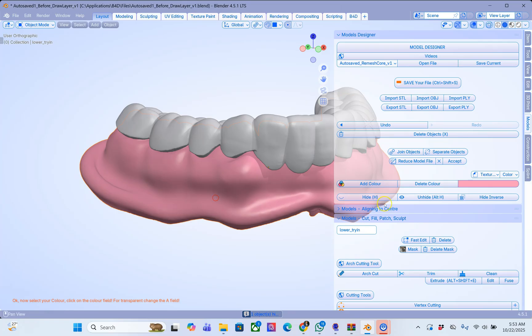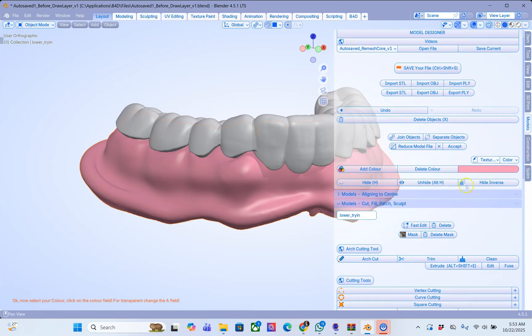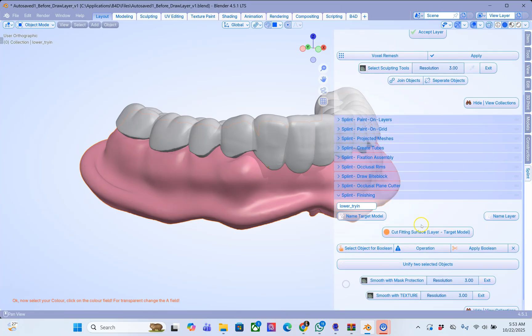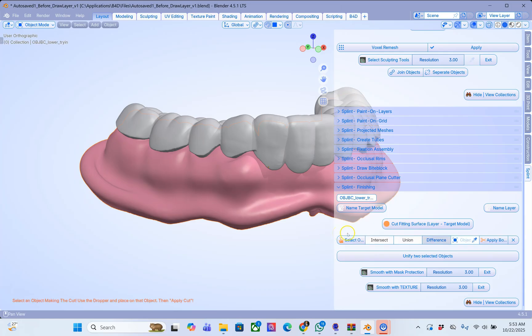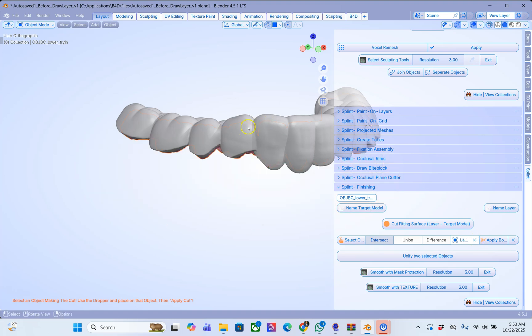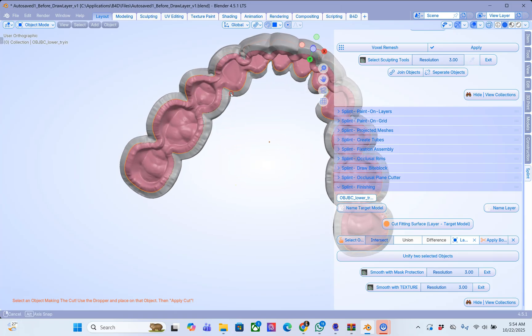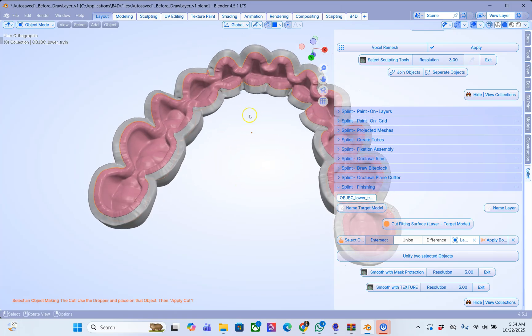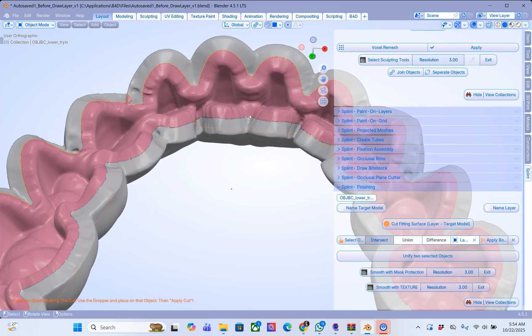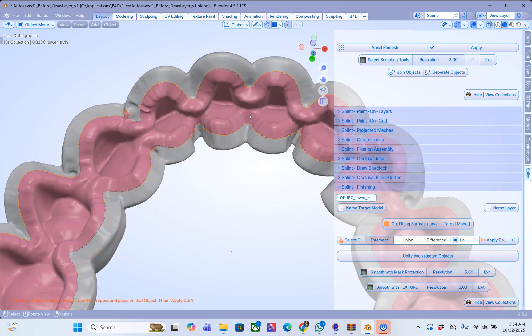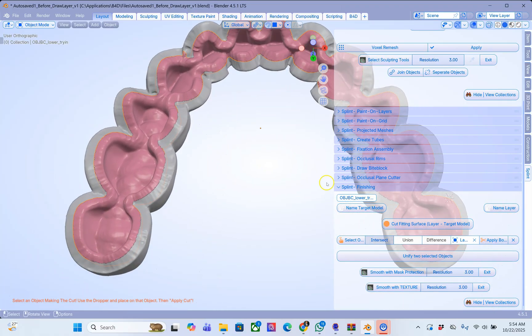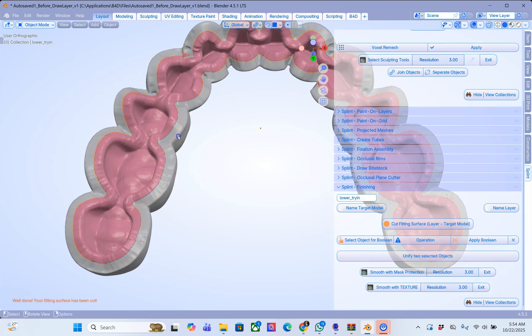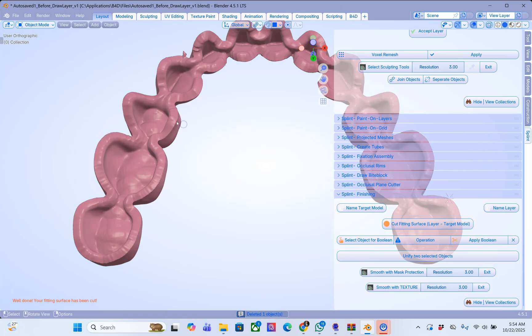Now what we are going to do is go into the splint module. Go to the finishing. And we are going to with it being selected, click on select object for boolean. And then we are going to create an intersection. Take the dropper and select this layer. And this is what I want to see. And we are going to then apply that. And then take your cutting tool X and delete it. We don't need it anymore.